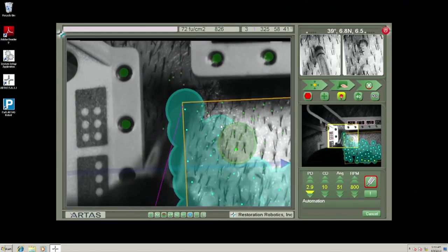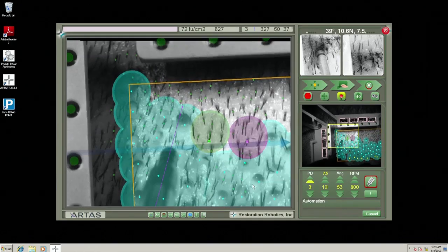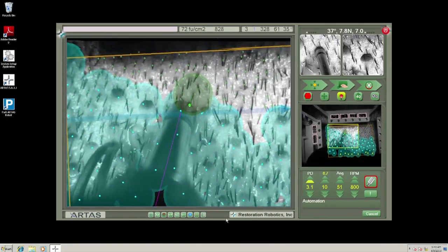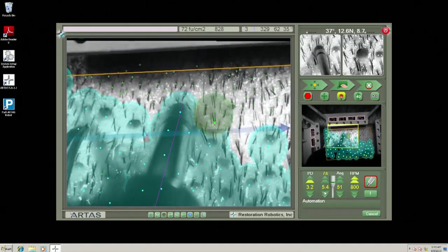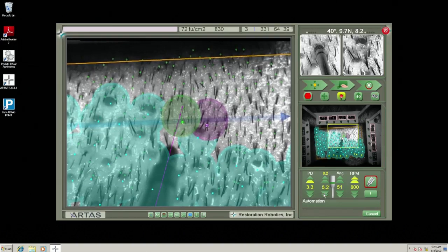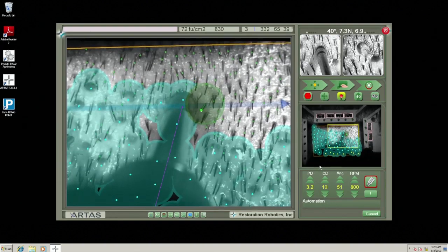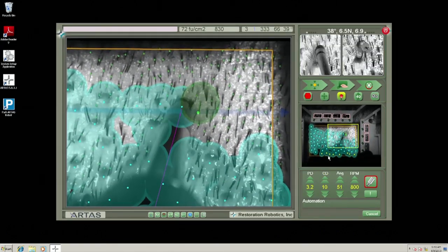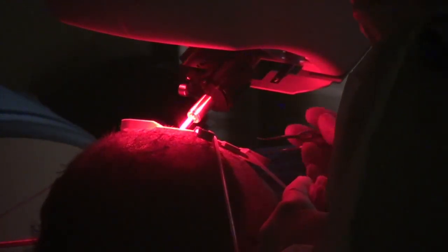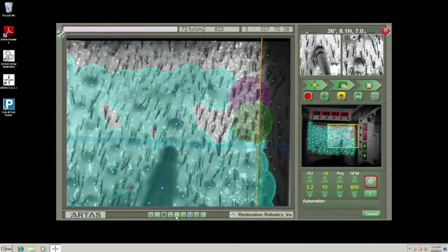And so our overlap at the bottom of each tensioner will be about 3 to 4 rows of harvested grafts, because we know we can't get to those grafts anyway. So we have good overlap. Now, the second thing that we'll do is that we'll leave 2 of the elastic bands strapped, and we'll raise the tensioner sometimes, and we'll advance it forward without having to completely disconnect the entire device. So we'll only do 2 of them, and then sort of march up by leaving 2 intact. Does that make sense? Hopefully that makes sense. If it doesn't, I'll try to say it in a different way.